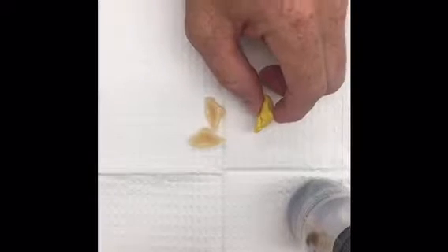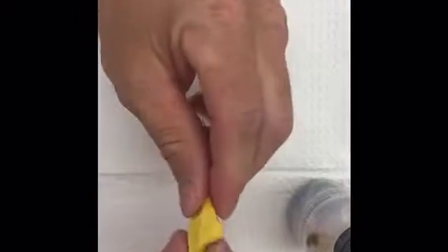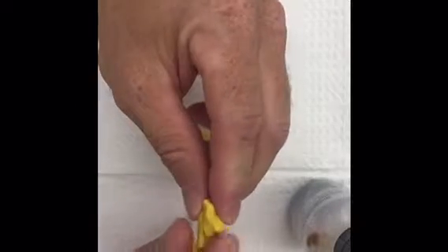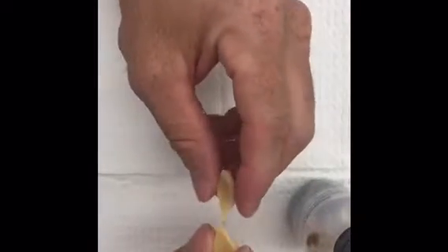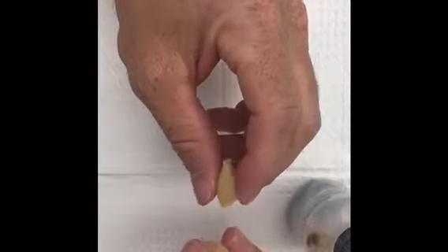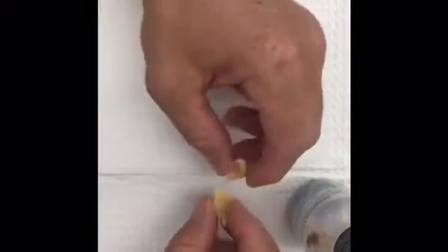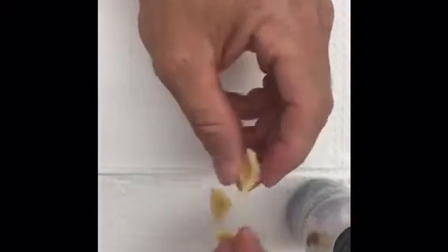I'm going to show you how I add and subtract wax when fitting an ocular piece. This is the impression — I cut off most of the material and was able to use this little piece here. I have a few copies with different shapes that I'm hoping will fit in and stay in. It's going to be a little tricky to keep it in because the lower lid is so shallow, but we'll try all three and see which one works best.